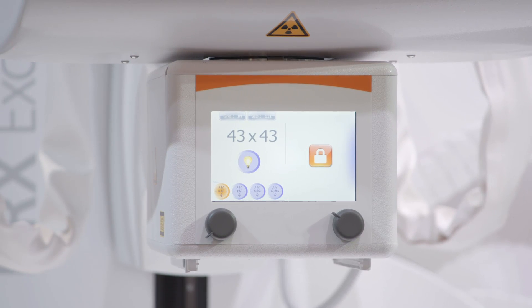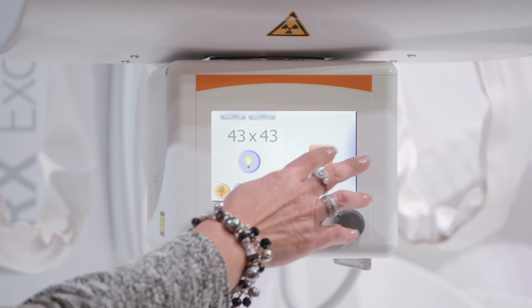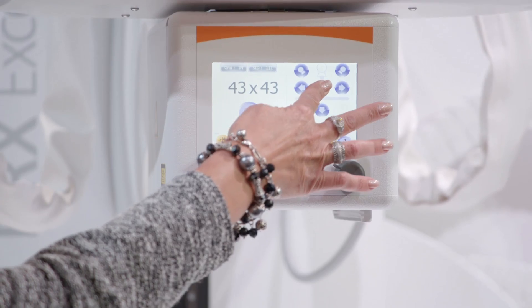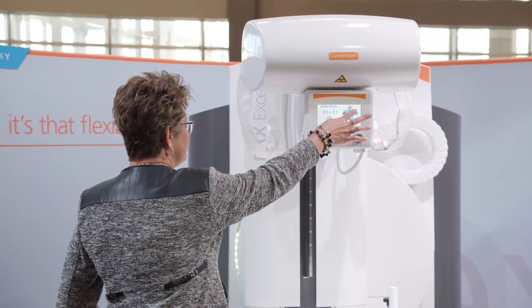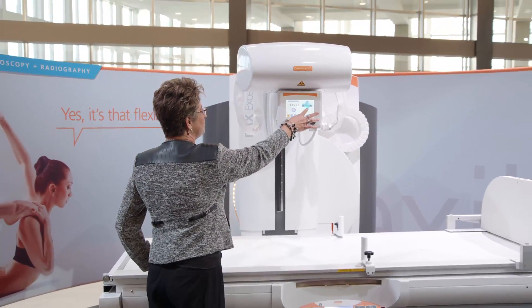I have several work zones for the technologist. You can see I can access my tube screen and actually lift and lower the table from here. I also have full table access as well — right to left, up and down, free floating.